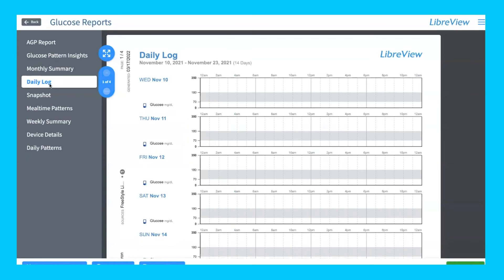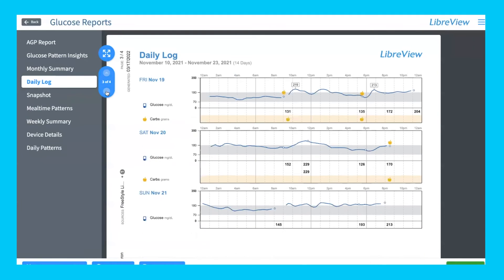The daily log is a deep dive into individual days, showing one page at a time. On page three, for example, you can see Friday, Saturday, and Sunday, with meals marked by little apple icons. The blue line shows your average glucose, and it also marks when you had a high above your threshold. My high threshold is 180, so a reading of 219 is flagged. This lets your healthcare provider see exactly how many times you were out of range above your highest threshold.